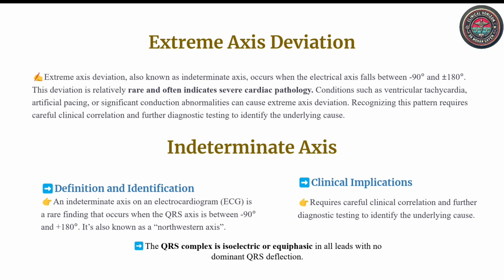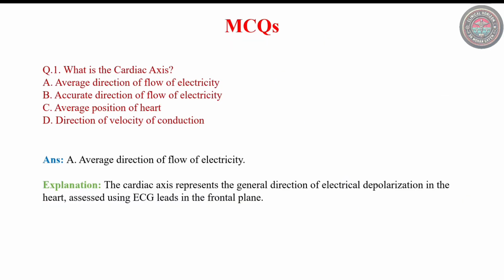Now that we have covered the fundamental concepts of cardiac axis determination, it's time to test your understanding through a series of multiple-choice questions, or MCQs. These questions are carefully designed to reinforce key principles and help you apply theoretical knowledge to practical ECG interpretation. I encourage you to think through each question carefully before I reveal the correct answer and explanation.